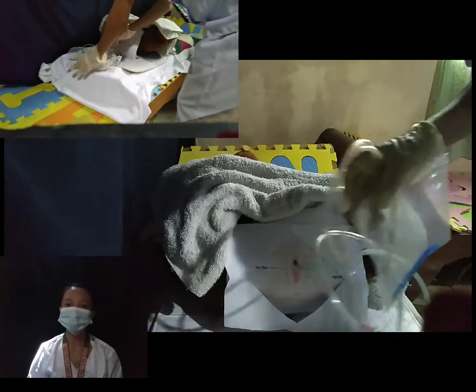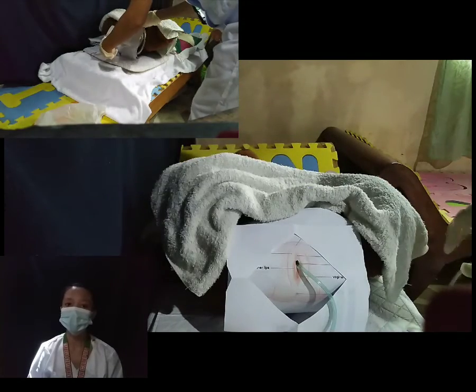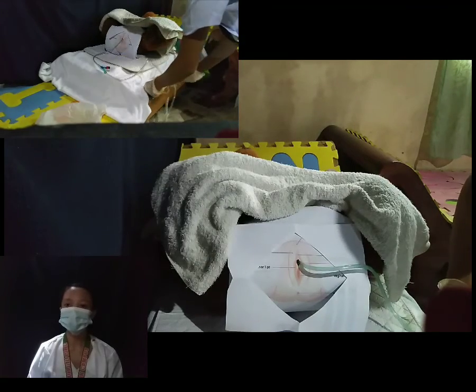Now that we have successfully inserted the catheter inside the urinary bladder and it is properly anchored, we will now place the collection bag just below the hip to prevent ascending backflow, and make sure to tape the tube at the inner thigh to prevent tension and pressure on the urethra to make our patient feel comfortable. So we're going to take the collection bag and place it just below the hip at the bed frame.